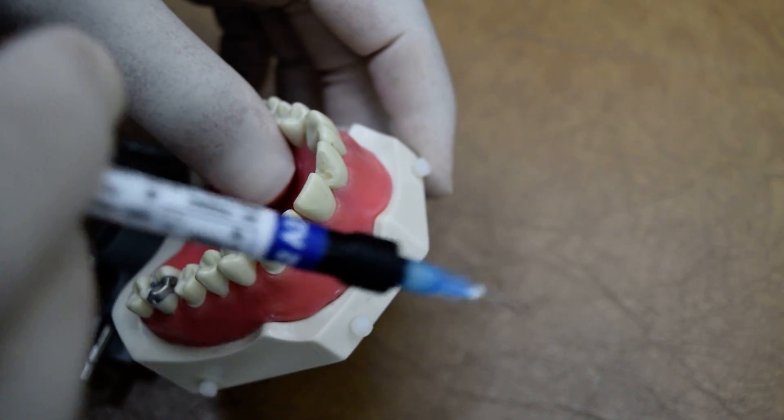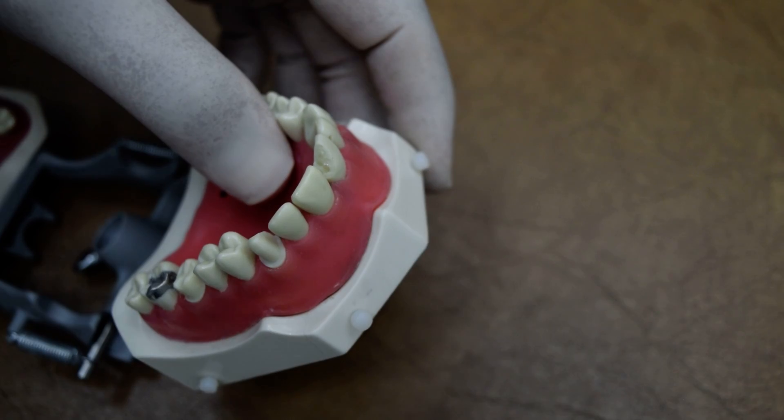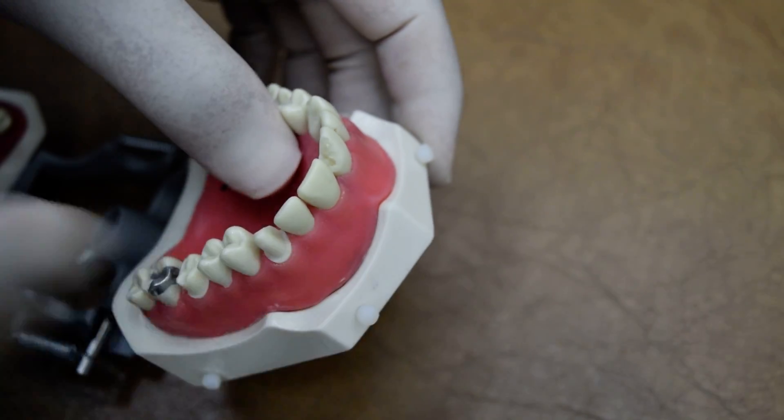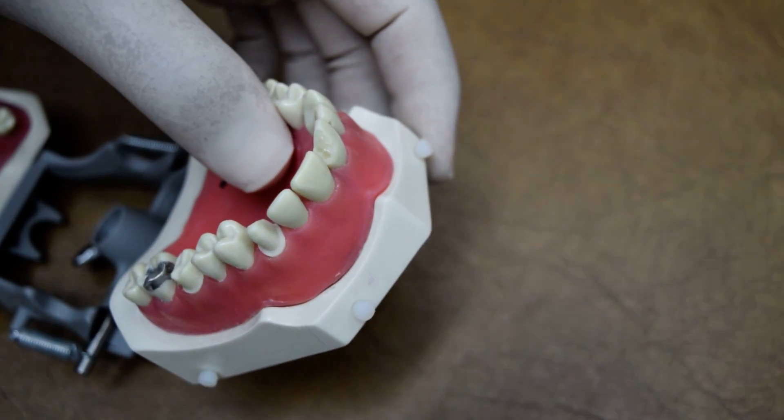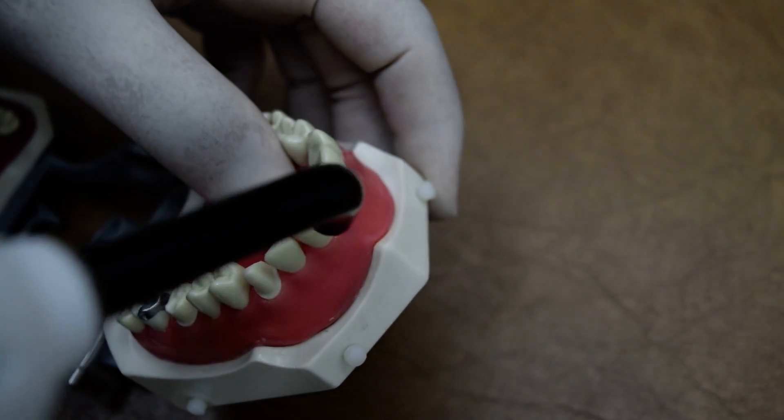And it is allowed to do any modification in the cavity before you do the restoration. Then we will apply the light cure.